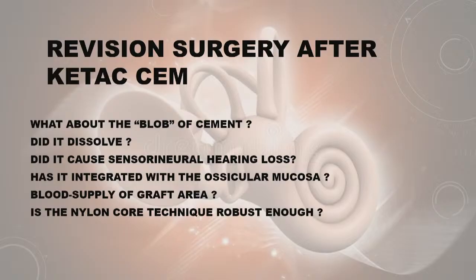But it was only in about 2011, 2012 that we started with a nylon technique. Since we started using the nylon technique, very, very few, in fact on one hand I can count, have broken down or come loose. So it doesn't dissolve, and it never caused sensorineural hearing loss. Has it integrated with the ossicular mucosa? Well, I'm going to show you that in a little while.